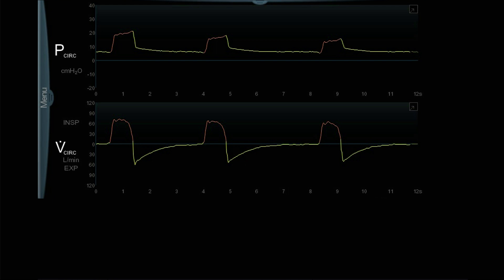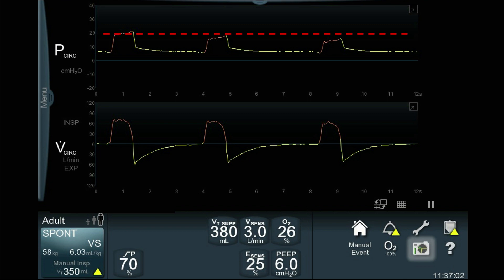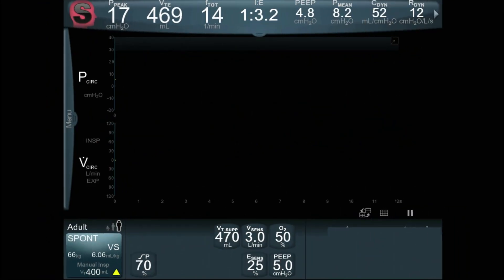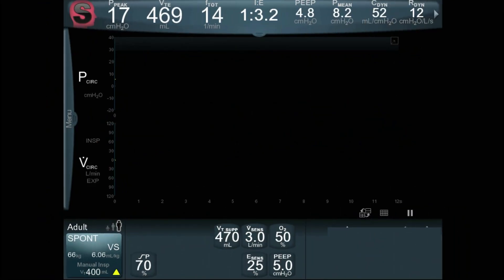This is volume support — not pressure support, even though it looks like it. I can demonstrate why: if I draw a line on the pressure waveform, you can see that each of the three breaths represented, which look like they have normal flow patterns, actually have different pressure levels. When you open up the picture you can see this patient is breathing spontaneously on volume support with a set volume of 380 mils, a flow-by of three liters, and an expiratory sensitivity of 25%.